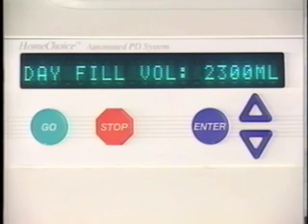The third is day fill volume. This includes the volume of solution for each daytime exchange. Please note, this may be a different volume from the night fill volume. Press the down arrow again.